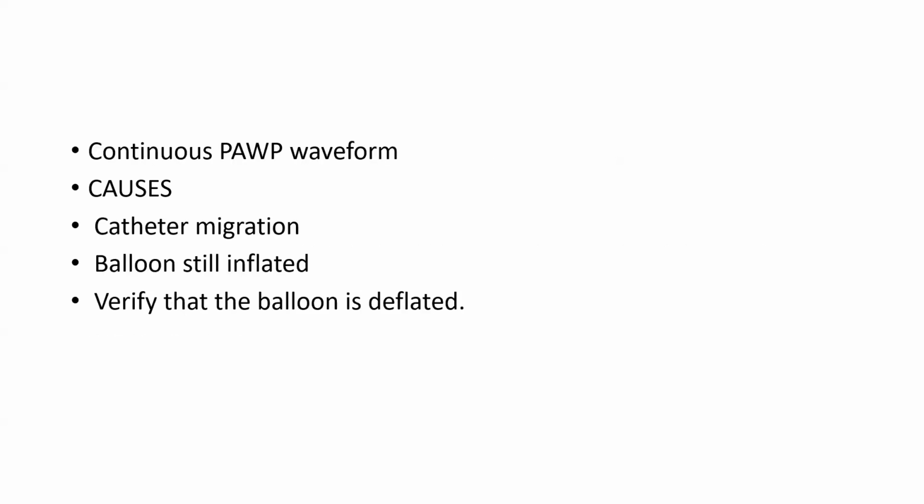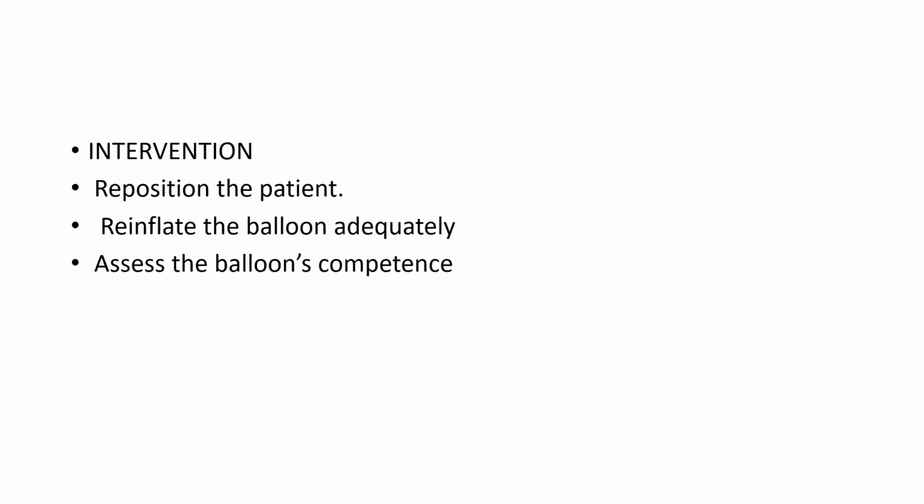Now the continuous pulmonary artery wedge pressure waveform. The causes are catheter migration or the balloon being inflated, so verify that the balloon is deflated. And the intervention: reposition the patient, reinflate the balloon adequately, and assess the balloon's competence.